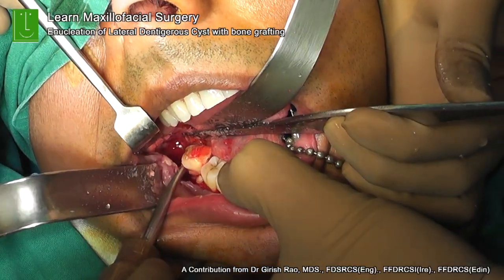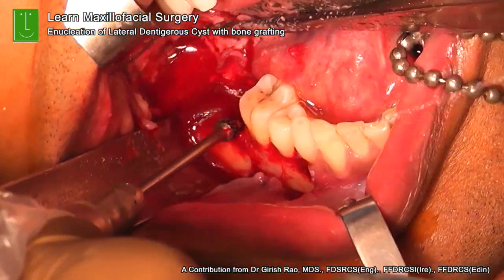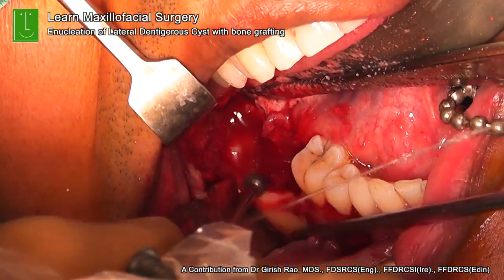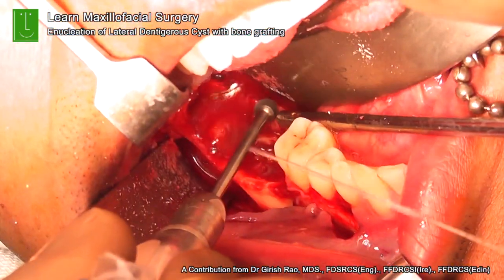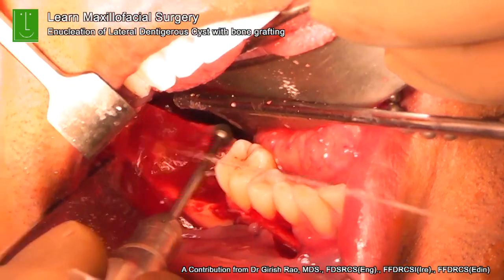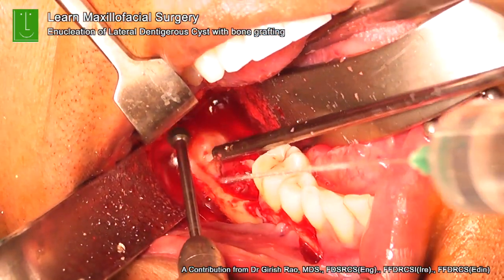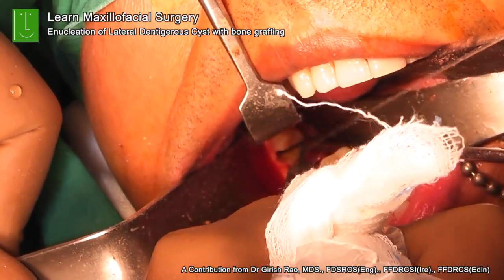That's the second molar coming out. The resorption of the root has happened, so you can see the complete tooth is taken out. And once you do that, then again you get back your rosette surgical burr, and you can see the way in which we are taking out both the buccal and the cortical plate. There was a perforation of the buccal cortical plate, which the cyst had already perforated. So I'm trying to preserve the rim of the buccal bone above the perforation, so that the height of the ramus of the mandible and the body in that area, in the angle region, is preserved.